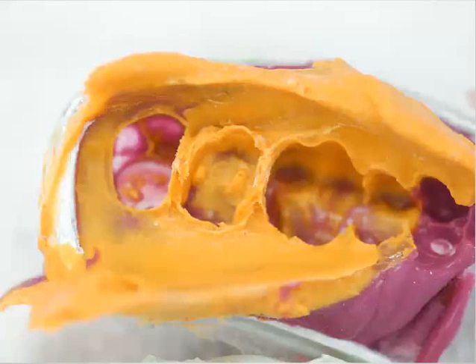Impressions should be free of flaws such as voids and folds and creases and tears and ragged edges around the margins. We need to have very sharp, distinct margins and smooth axial surfaces, and that's really paramount to the fabrication of these crowns, especially when you talk about digital scanning of the models by the dental technician for the construction of these very accurately fitted CAD/CAM or pressed restorations.